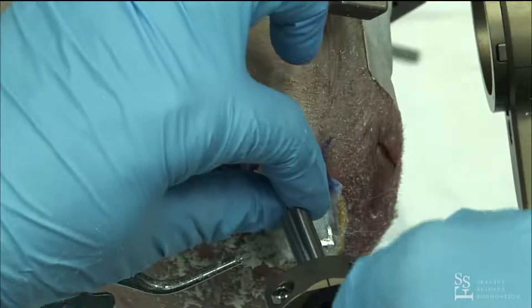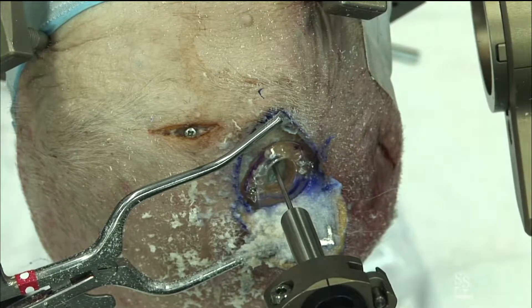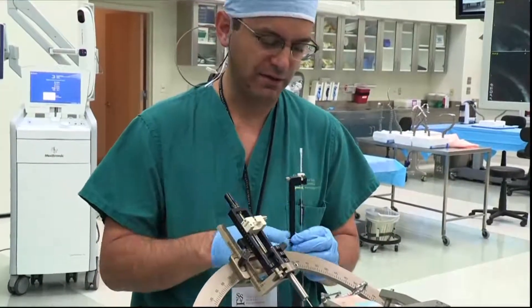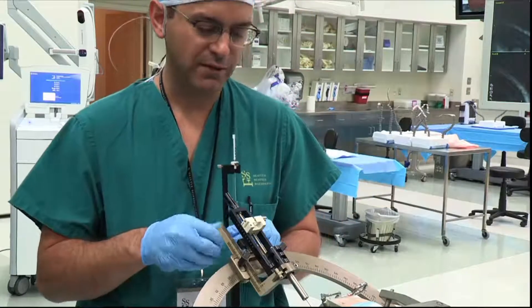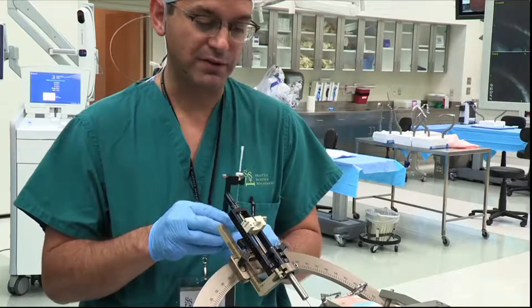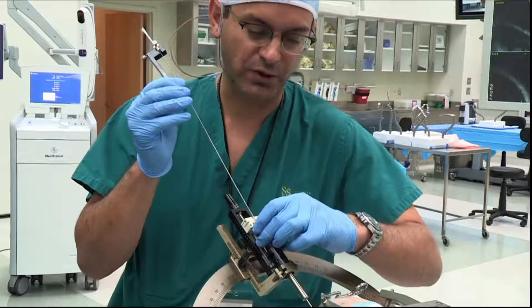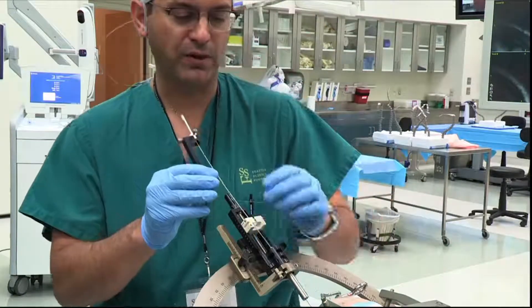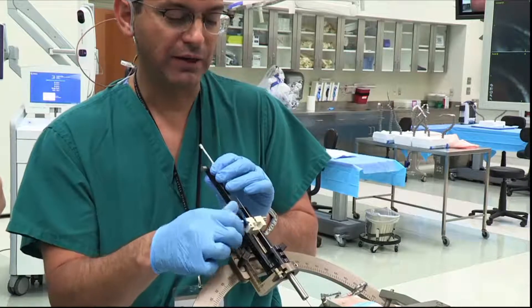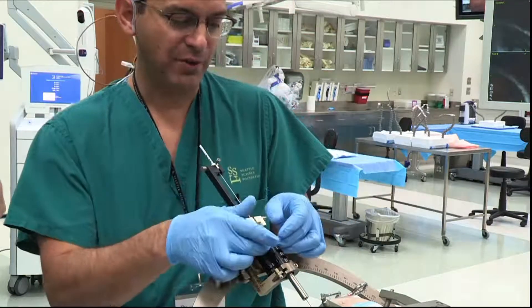I'll get a little Penfield 1, which usually fits just perfectly through this little hole. My microdrive is set at 10 would put me at target; I put it at 13.75, which means for an STN I'm targeting the middle of contact 1 — the second contact up at target, so I have one below. Now we are ready for our lead. As part of circuitry — CHIA: circuits, hemorrhage — we just put this in taking a pause, taking it easy as the cannula goes in. I always check impedance for the system before we take the stylet out. I is infection: we take a lot of steps to avoid infection — time is one of them, the longer a patient's exposed the more risk. We've been using antimicrobial envelopes. And A is accuracy: I tell patients you don't leave surgery without a lead within two millimeters of my target.